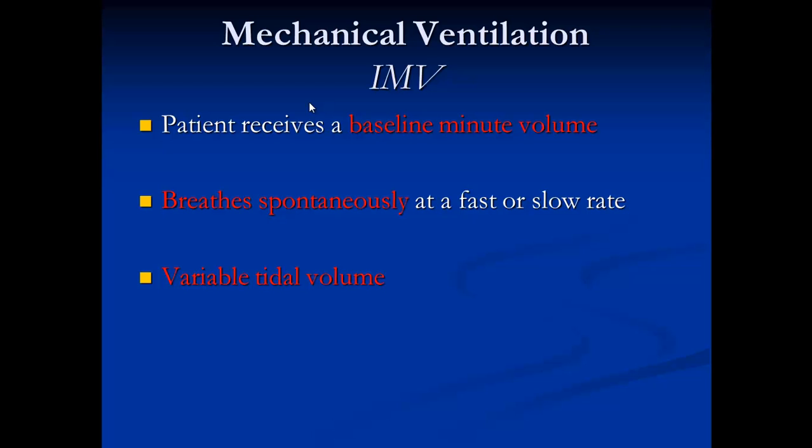Typically, SIMV is initiated at a setting to deliver full ventilatory support, and support is then decreased as the patient tolerates spontaneous breathing. So basically, when you put this mode of ventilation, you have to also put pressure support on it.